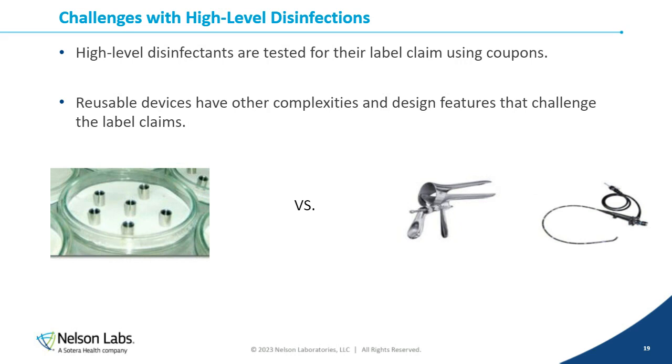Well, reusable medical devices are a lot more complex than a coupon. They have challenging design features, such as crevices, areas that actuate, and lumens, that might challenge the disinfectant a little bit more than that coupon.